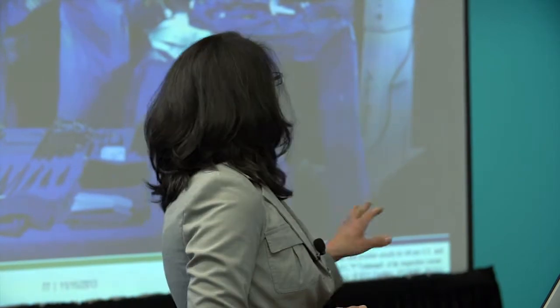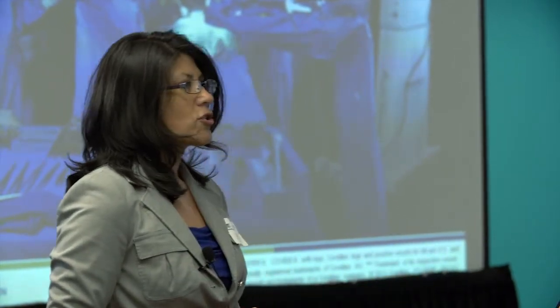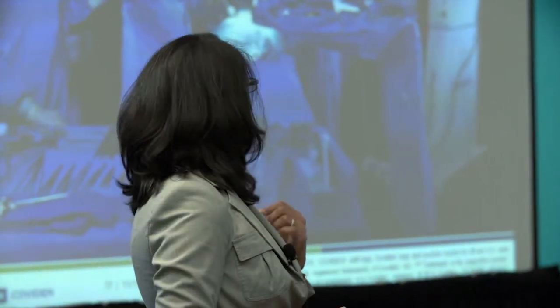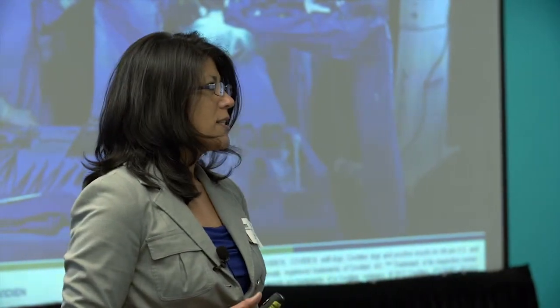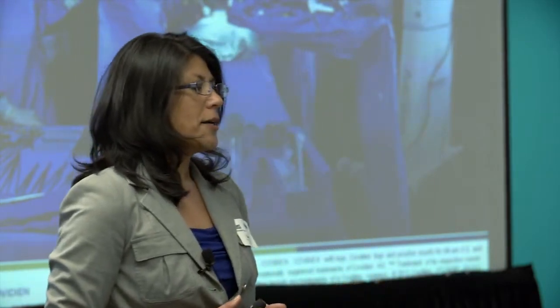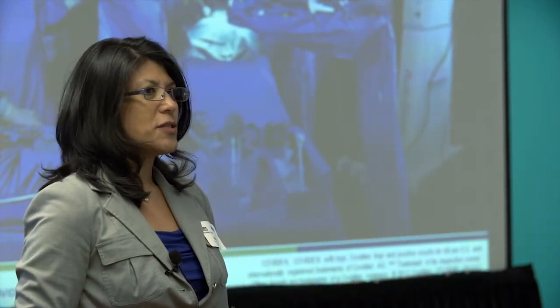So there's a lot of equipment, monitors, surgical kits, medical instrumentation, and the environment itself can be variable. I already talked about the sterility, but this space is variable around the world. Different operating rooms are different sizes. It can be a very high stress environment at points in time. And then the temperature, the lighting, the noise, all play in the use environment here.